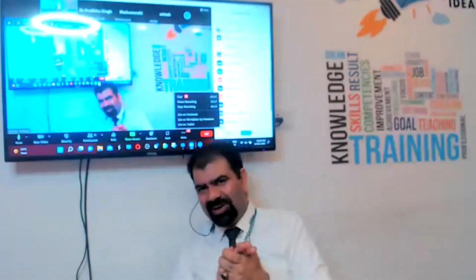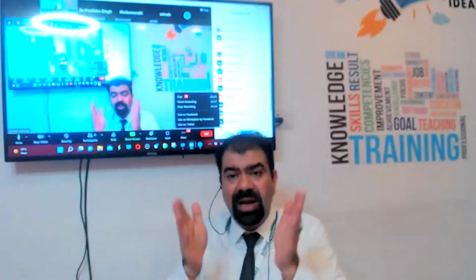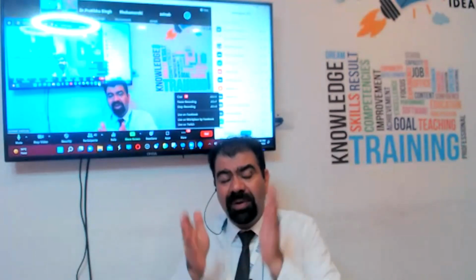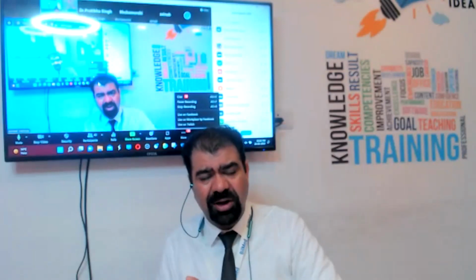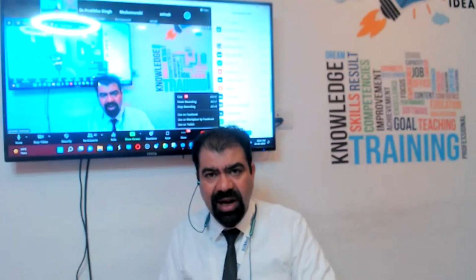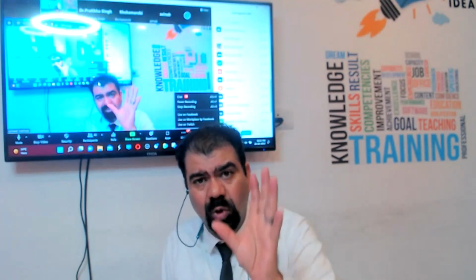So always and always put color on it when your patient is telling you, I have expelled everything. Put color onto that endometrium, irrespective of its thickness. If even a 2 millimeter endometrium is showing you a bunch of color, that makes you think, oh, there is an RPOC which is not getting visualized, but what I am seeing is the result of the RPOC, that is, high blood flow in a small given area.